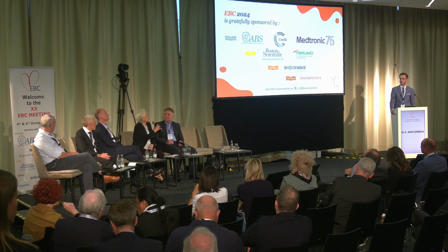Okay, and I have a question. In your case, you are lucky because you chose a very big size balloon, so 4.0 millimeters. In the era of balloon angioplasty, usually the balloon to vessel size ratio is over 1.3, and it can easily develop severe dissection, flow-limiting dissection, I mean.